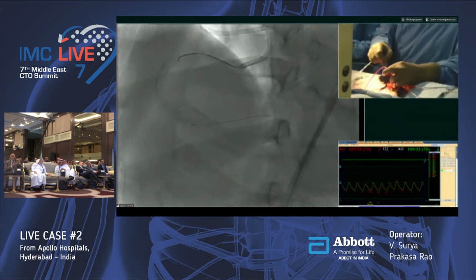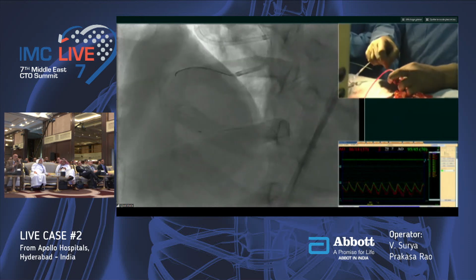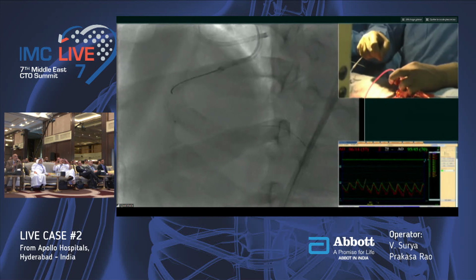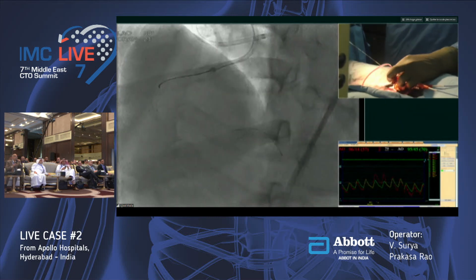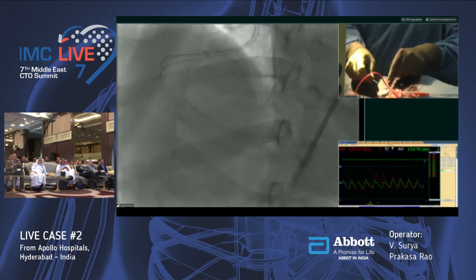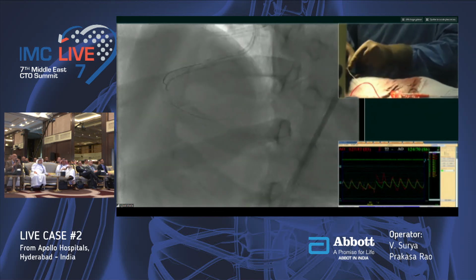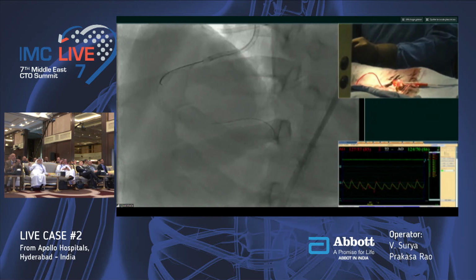Difficult. So it's a very hard calcific region, multiple layers of stents. I think if it is retrogradely filling, I'm happy with that. So do you have another solution? What about Alexander?